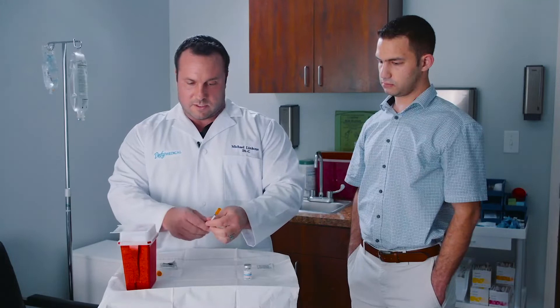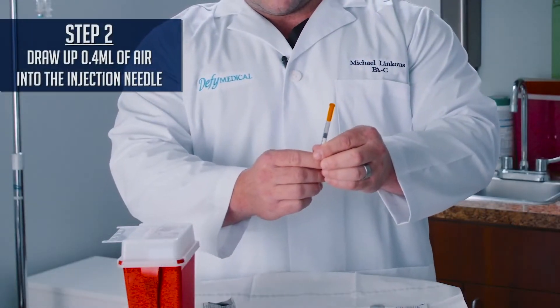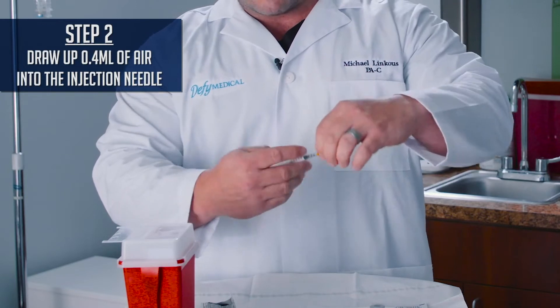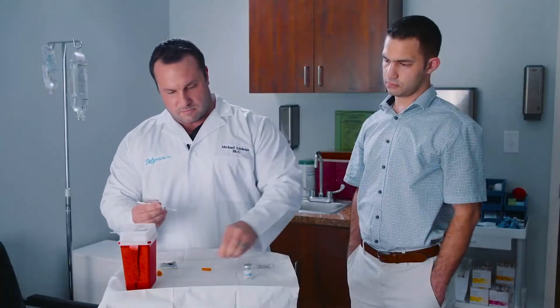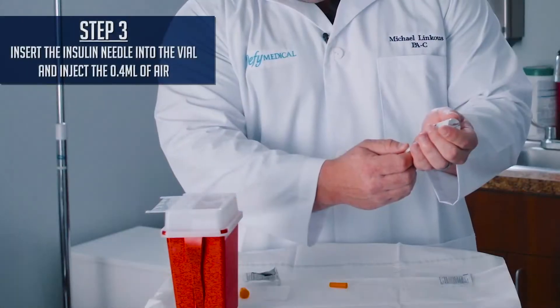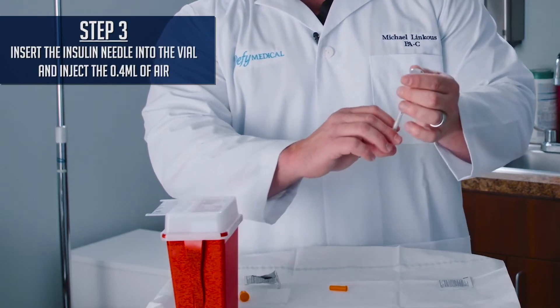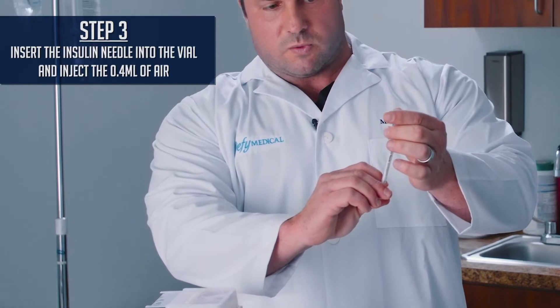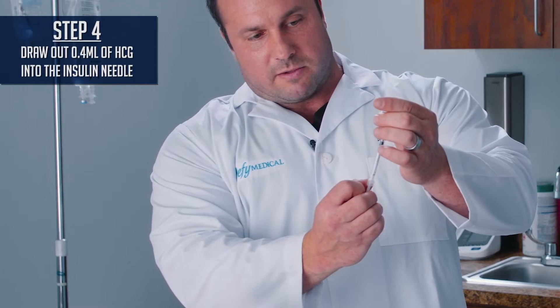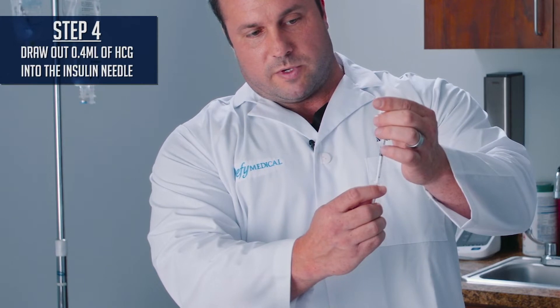With the insulin needle, we're injecting 0.4 mLs on the patient, so we pull down to 0.4 mLs on the syringe to allow the air to come in. Remove the hub. Invert the HCG bottle, making sure that the needle goes into the circle of the rubber and doesn't touch anything else, and push all the air up into the HCG bottle. Then pull back to 0.4 mLs.